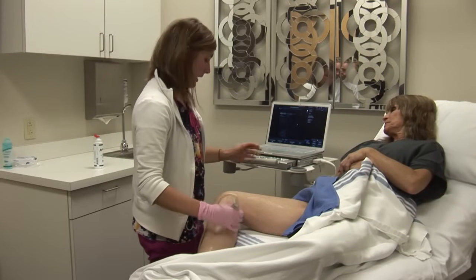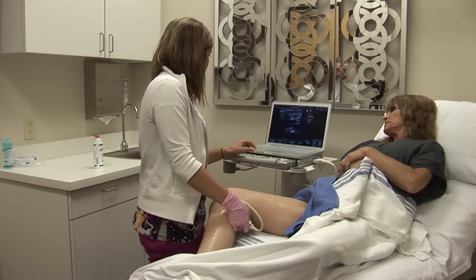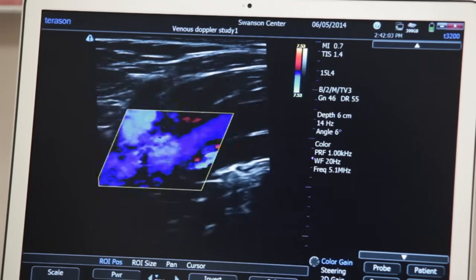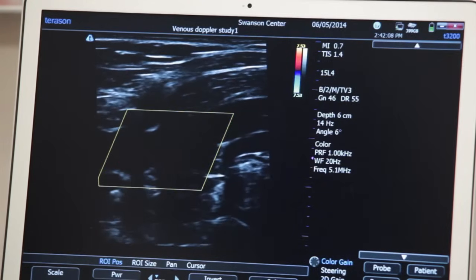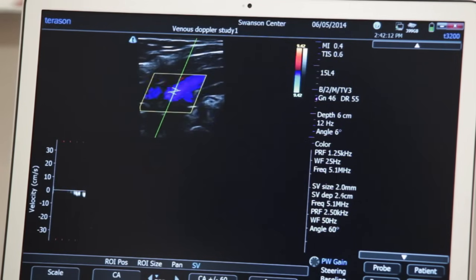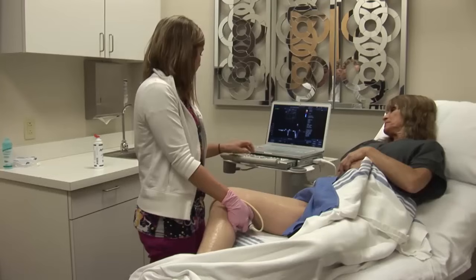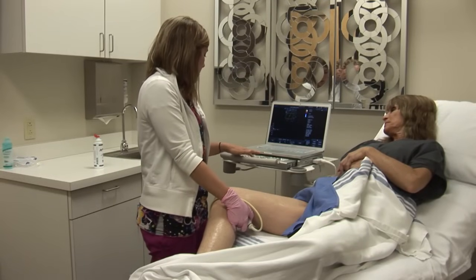Now I move back up to my popliteal vein, showing nice color fill, no defects — where there could be thrombus. I turn my pulse wave on again and do my augmentation, making sure I get a nice spike with each augmentation.